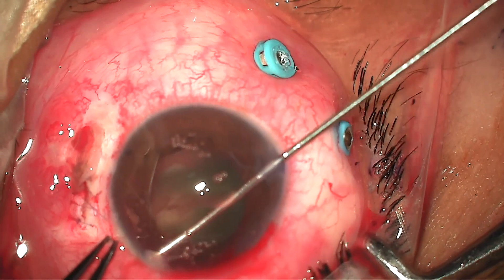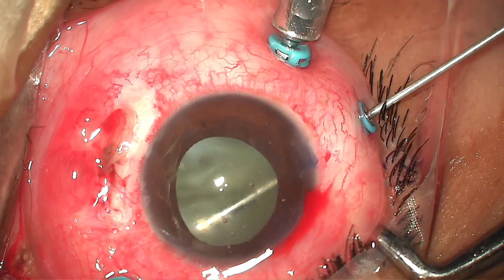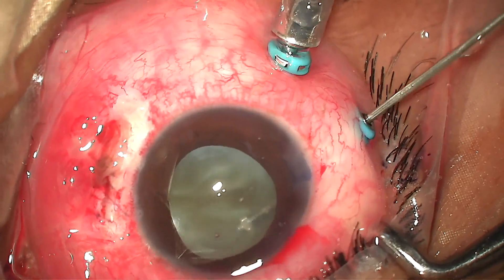Diathermy was done to stop bleeding from the iris. Going behind the posterior capsule, anterior vitrectomy was done and the vitreous hemorrhage just beneath the posterior capsule was cleared for better visualization.